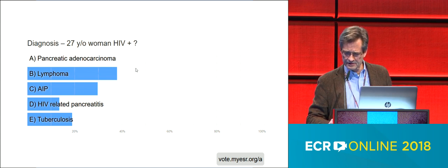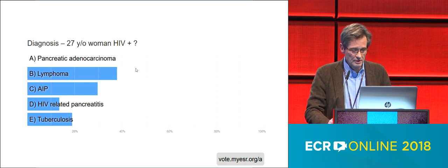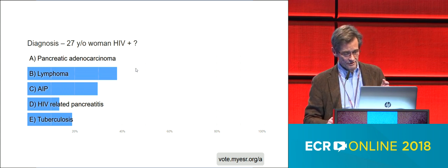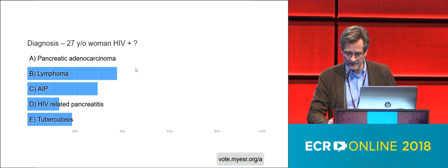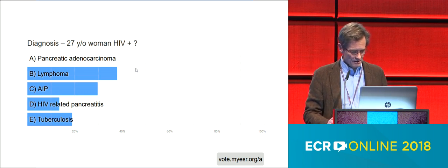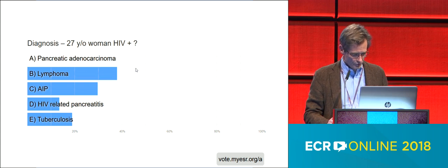AIP, certainly this patient presents with a pattern that could correspond to an autoimmune pancreatitis, since she has an enlarged gland, she has strictures, and she has this ring of enhancement in the periphery of the pancreas. And in addition, she presents with multi-organ involvement, since the right kidney at least was involved, at least on the imaging side, since the biopsy was considered non-contributive.